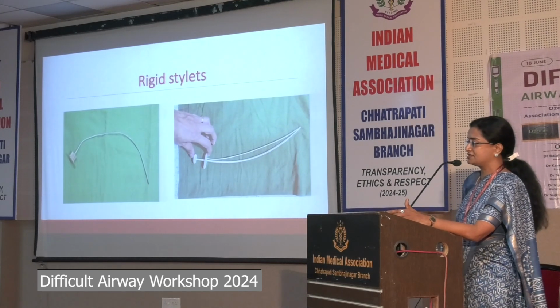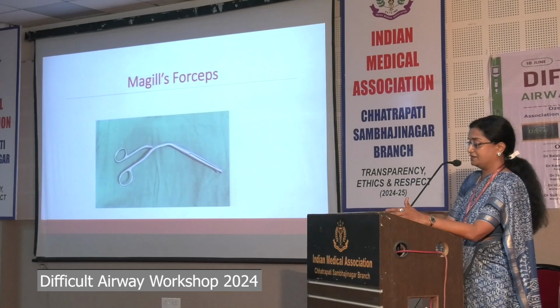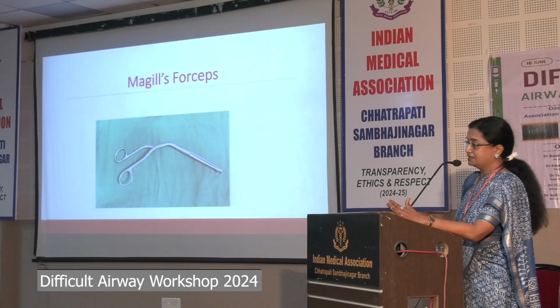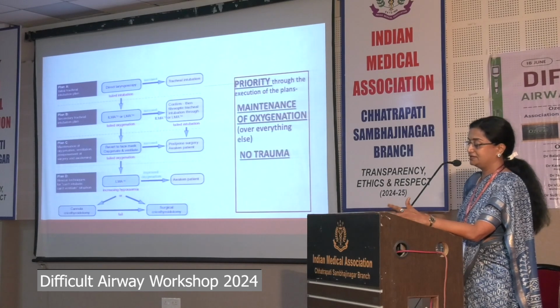These are the rigid stylets which are not in use any longer, but then it can save a life. Magill's forceps is an extremely useful equipment which has to be there. A clot or a thick mucus plug can be easily removed, and also if you break a tooth while intubating.